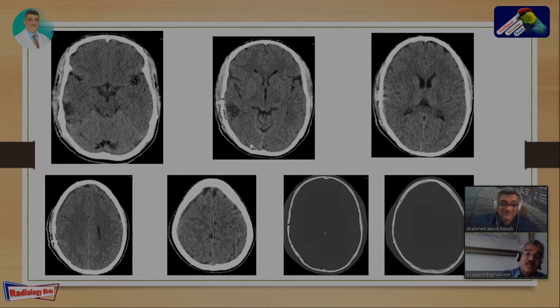It was toxoplasmosis, in a patient with drug abuse and lots of medication. It seemed an easy case from the beginning by the CT scan, but the result was a surprise for us after we saw the MRI.